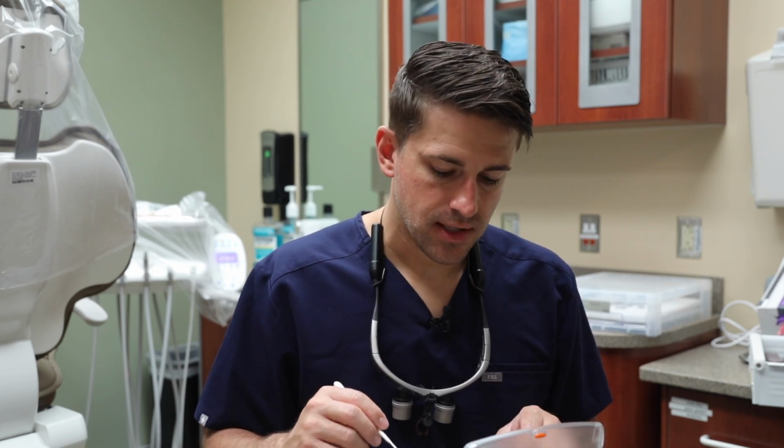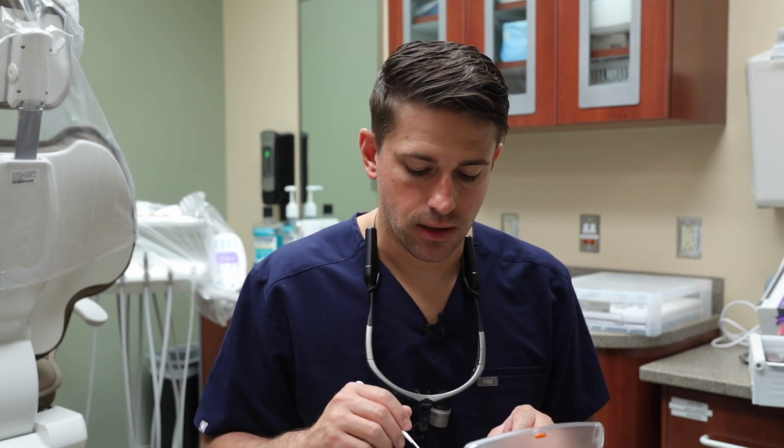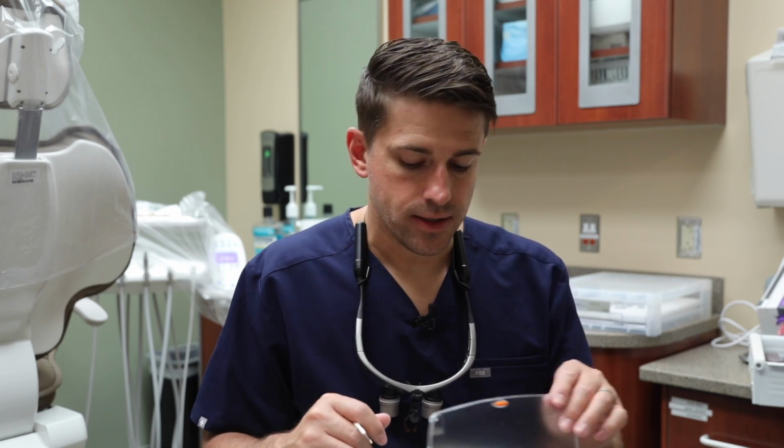because over time the liquid in this glaze or in any of the stains that you mix up will dry out, and that's something you need to consider. So a lot of times if they have been sitting for a little bit or on the counter for over 24 hours, you probably lost some of that liquid. I would mix in some liquid just to make sure that it's a good consistency for applying it to the crown. All right, so let's go check on the crown, see if it's ready. As soon as it's done, we'll come back here, we'll put the glaze on, and we'll do a correction firing.